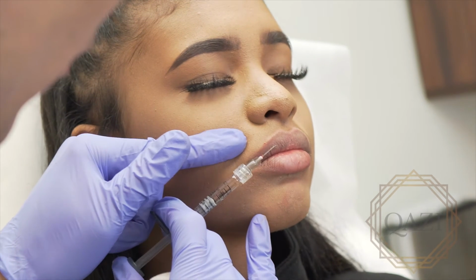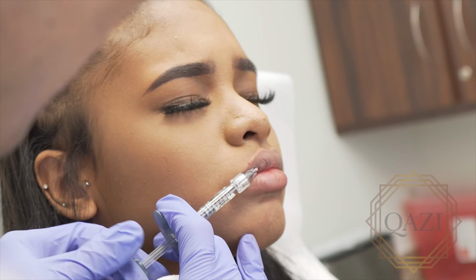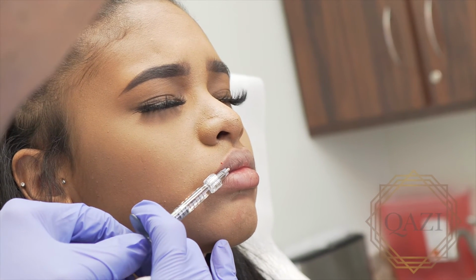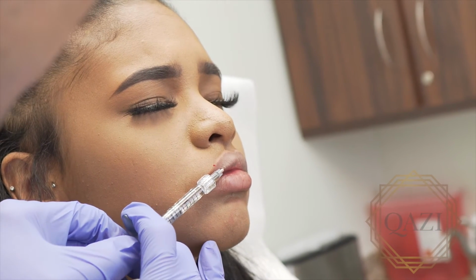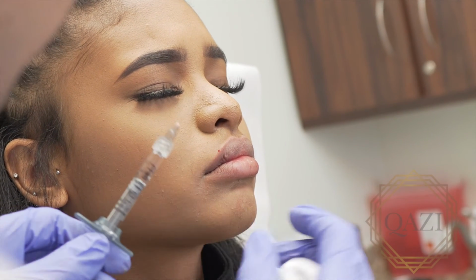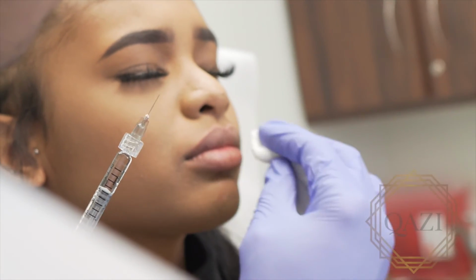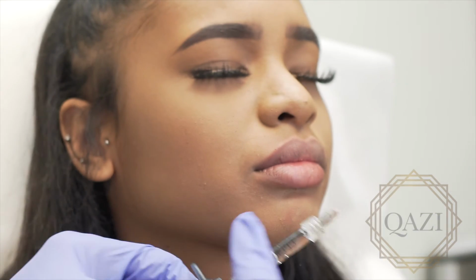In certain areas, as I go deeper particularly, or closer to the inferior labial artery or the superior labial artery, I do aspirate. So as you could see over here, in this area, the superior labial artery could be present. So I aspirate for a few seconds, and then I do a retrograde injection.